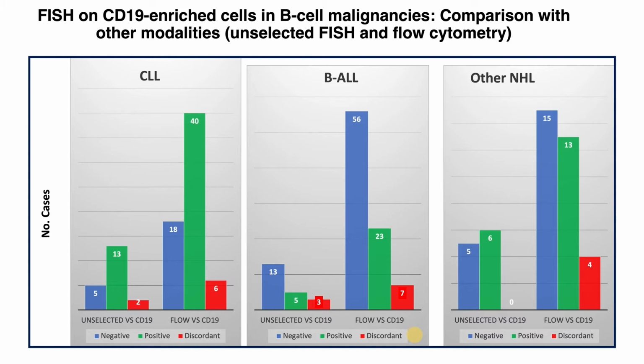To address these differences, we analyzed the data as negatives in both comparisons, positives in both comparisons, and discrepant in these comparisons. The blue color shows the negatives and green shows positives. Red shows discrepancy between two comparisons.